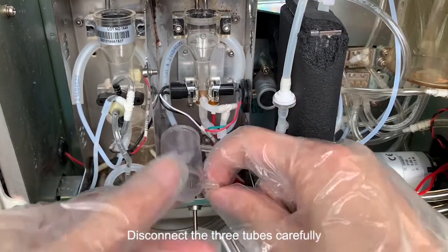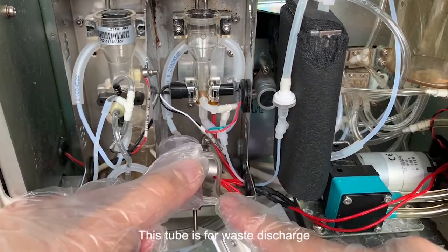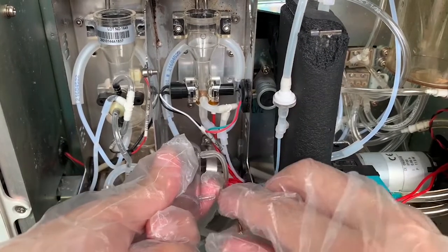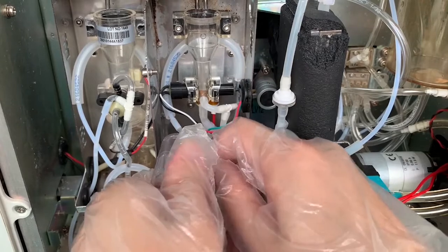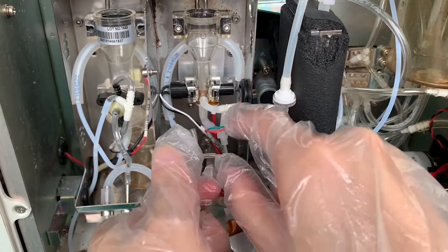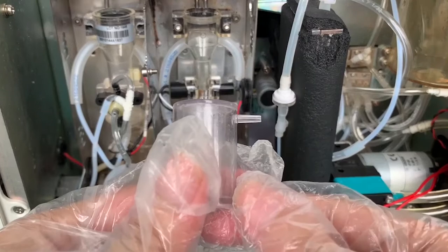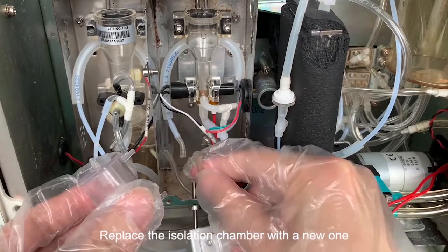Disconnect the three tubes carefully. This tube is for waste discharge. This tube is for air bubble mixing. Replace the isolation chamber with a new one.